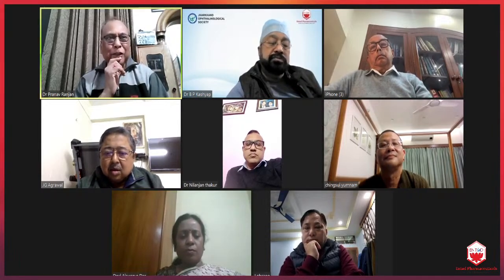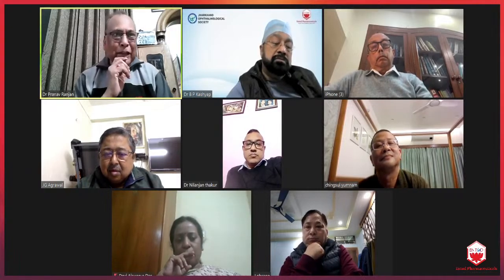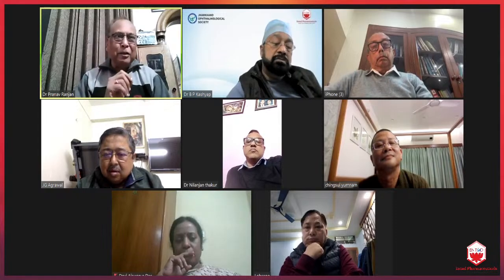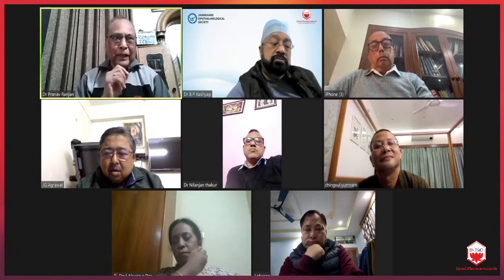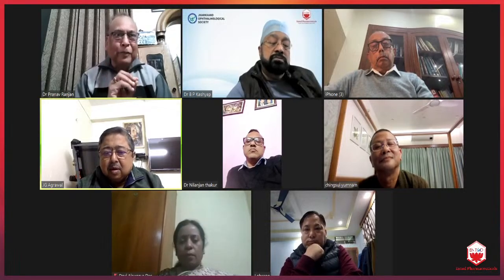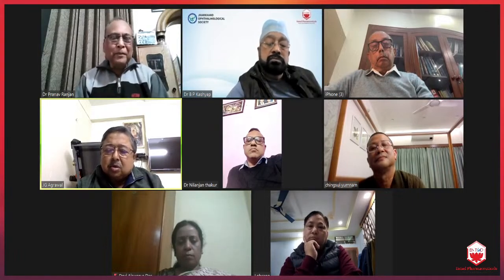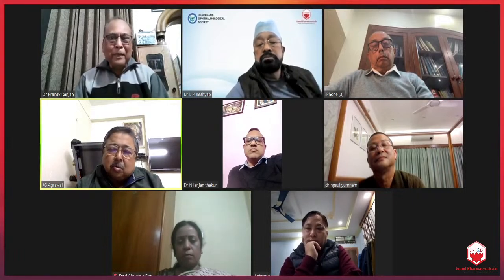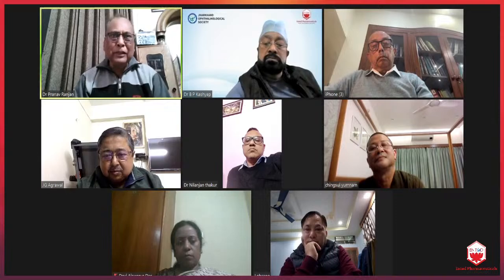One more question I wanted to ask Dr. Kashyap and Dr. Agarwal, both of them. While doing the optical biometry, if you put a lubricating eye drop, 0.5% CMC, will that have a good result? Just put a drop of lubricating eye drop on the cornea, wait half a minute, and then do the optical biometry. It will give a good result, because in our area almost 80% are suffering from dry eye in some way. So it is better to put a lubricant eye drop at least 3 or 4 days prior to the surgery.